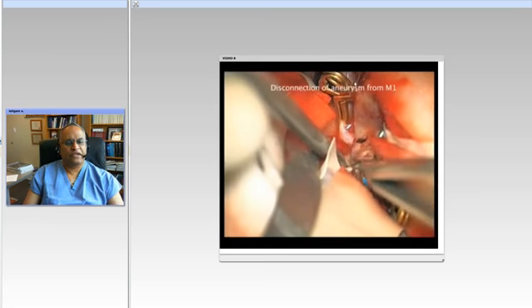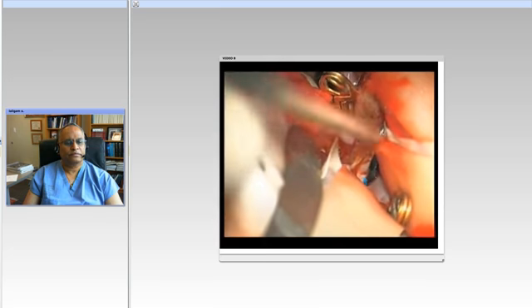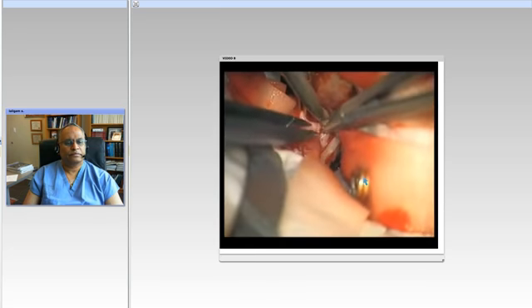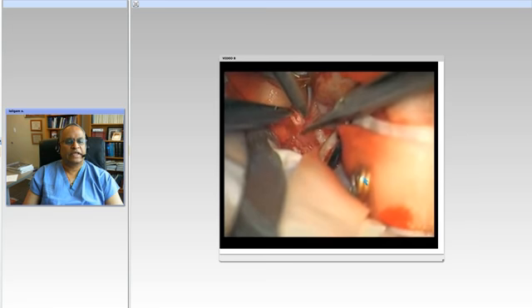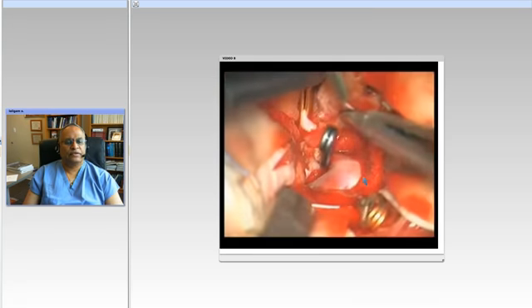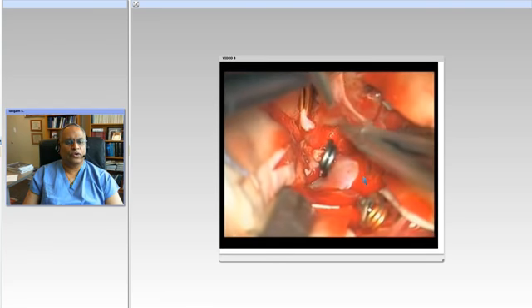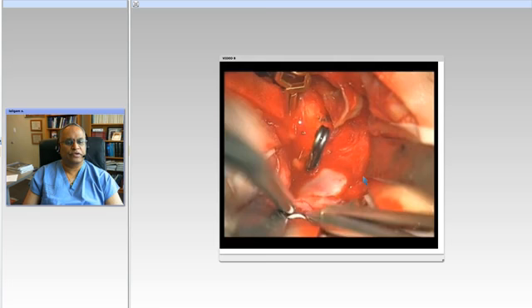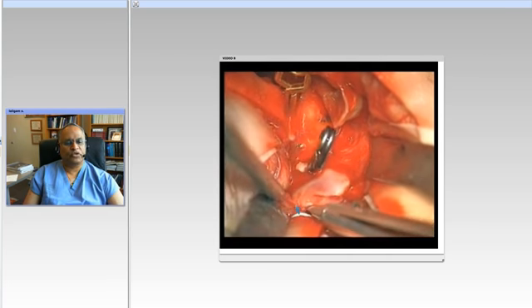So that's the first aneurysm. I'm just cutting out the aneurysm wall. And that is the artery as it runs into the aneurysm. That's the M1 vessel just beyond the terminal ICA. So that's what we have to deal with. So I'm just getting rid of that aneurysm, and then we still have this one. So here is another M2. We'll find the other M2.